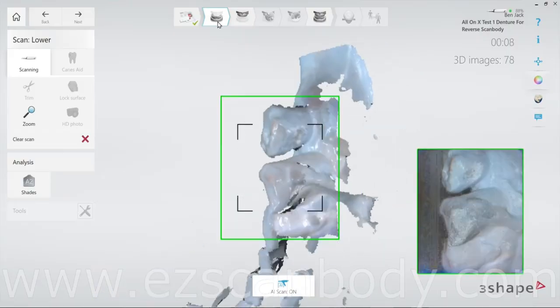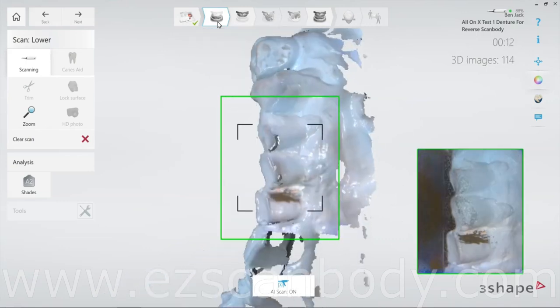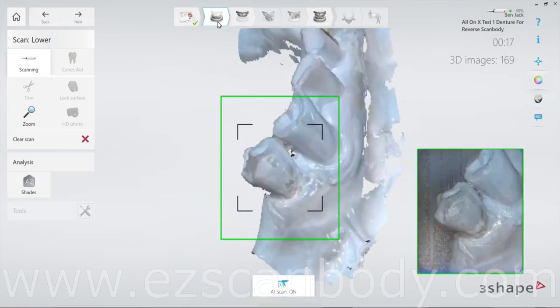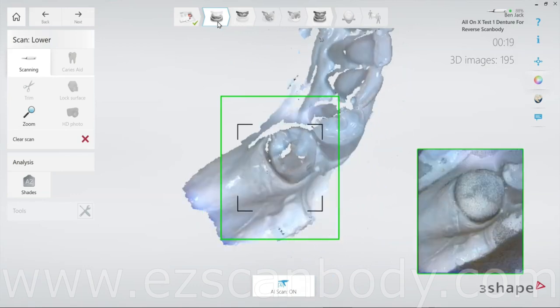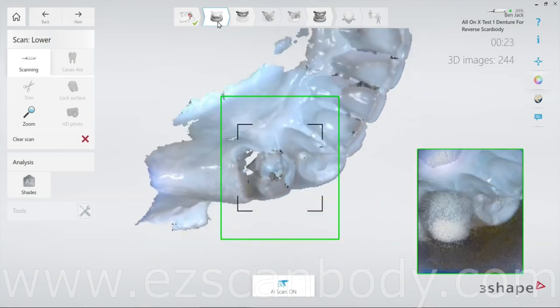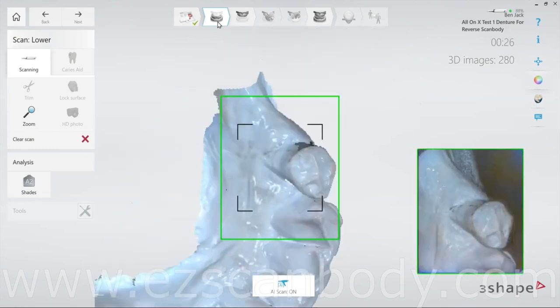Start by scanning the opposing jaw. Follow the scan protocol suggested by 3Shape to ensure accurate and consistent results — this sets the foundation for the remaining scans. Always make sure to scan the buccal side of the teeth completely to avoid any issues when scanning the bite.